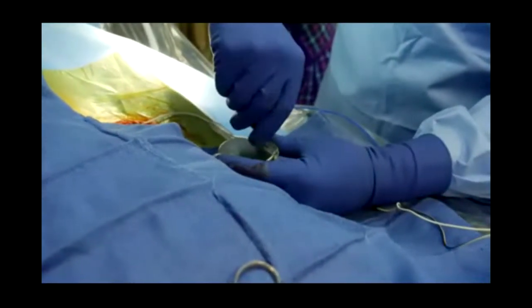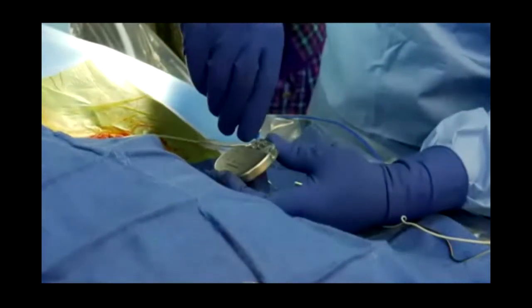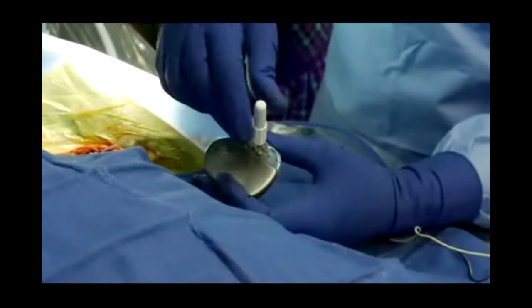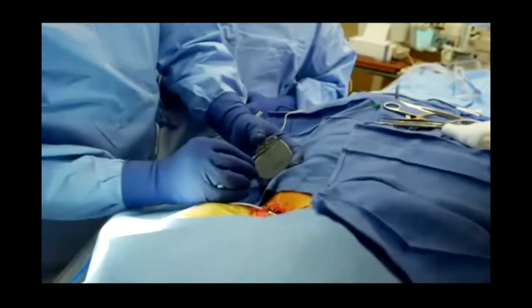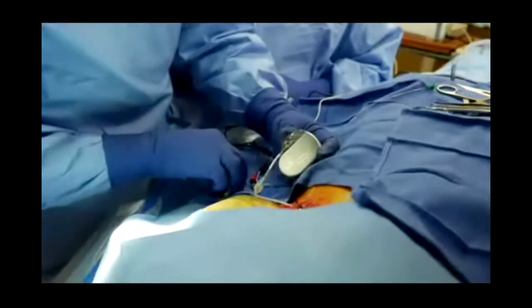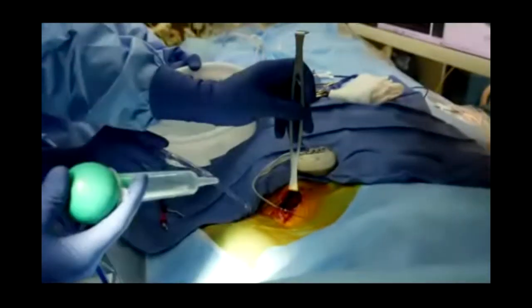So the lead is inserted into the ICD, and with that little screwdriver, we then secure the pins of the lead within the device header. Again, very securely, making sure that there's no chance of them coming out. We do the little tug test just to make sure that we have good purchase with the fastening technology there, the little set screw. So again, doing this step very carefully, we have a pin for the atrial sensing dipole as well.